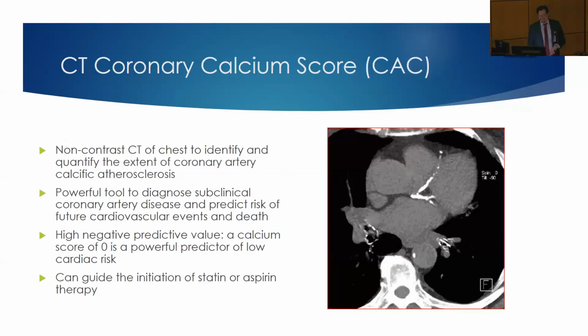All right, so let's move on to calcium score. Calcium score, very popular test now. I'm seeing a ton of them ordered. We're scanning a ton of them, which is great. I think it's a wonderful test, because it adds additional risk stratification information for patients with uncertain cardiac risk, because it's all about prevention now, stopping severe coronary disease from developing before they reach the cath lab.